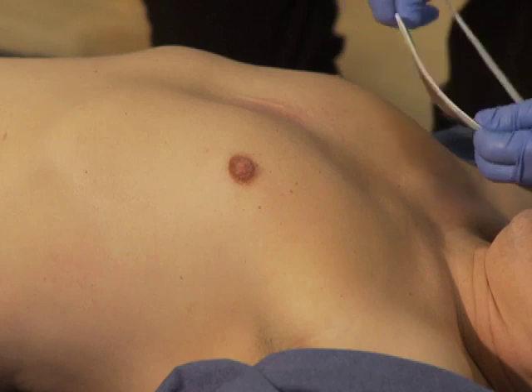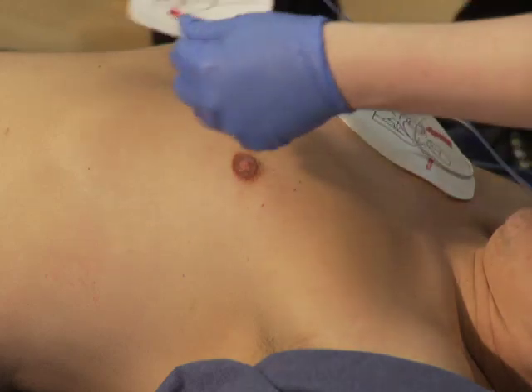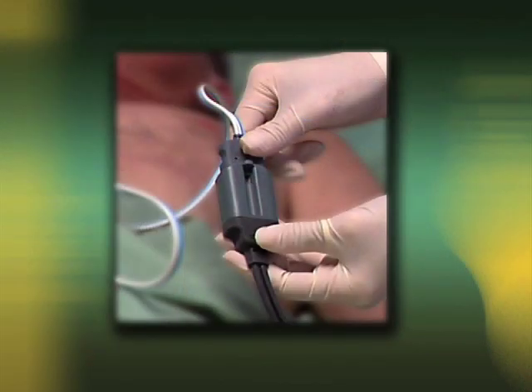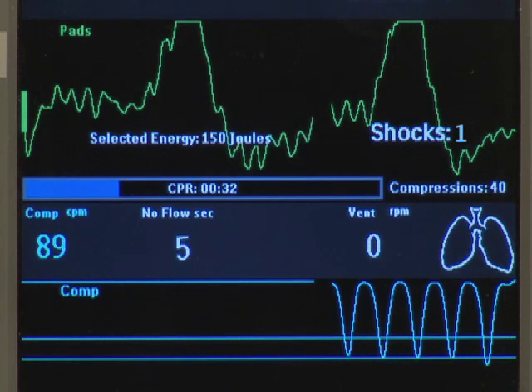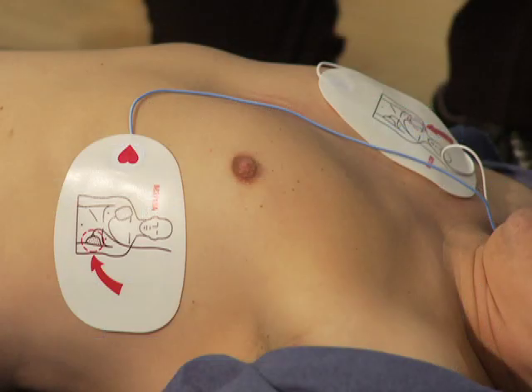When a situation arises requiring CPR, apply the multifunction pads to the patient's clean, dry, and hair-free bare chest in the anterior-anterior position, and verify the pads are connected to the pads CPR cable. The ventilation algorithm measures changes in chest impedance, which correlate with ventilation volume, necessitating the anterior-anterior pads placement.